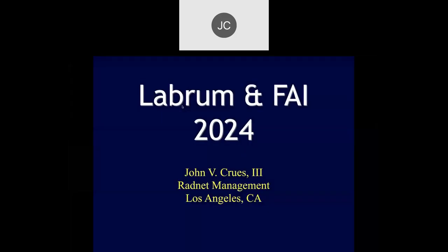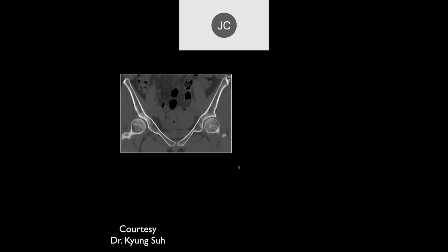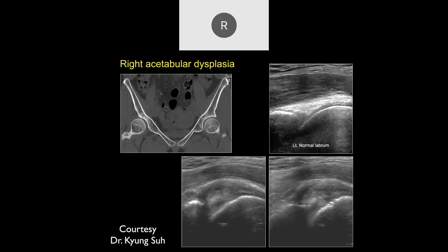Let's move on to labrum and FAI, staying on the hip. Robert, what do you think of this case — patient with right hip pain? Looking at the right hip, it looks like there's some acetabular under-coverage and a protuberance there, probably a little bit increased clear space medially than on the opposite side. On the frog-leg views we can again see the under-coverage on the right side. The CT scan confirms that, and this is what a normal labrum looks like — and this is actually a torn labrum.